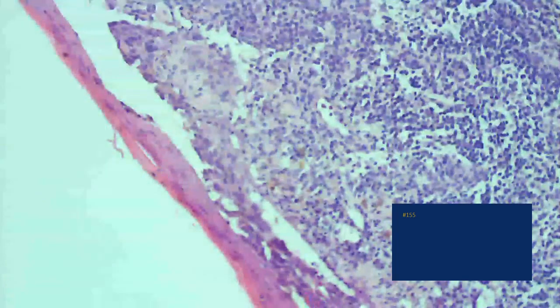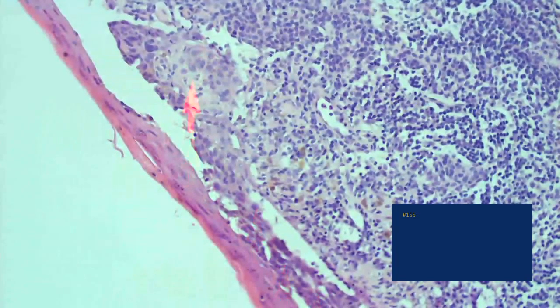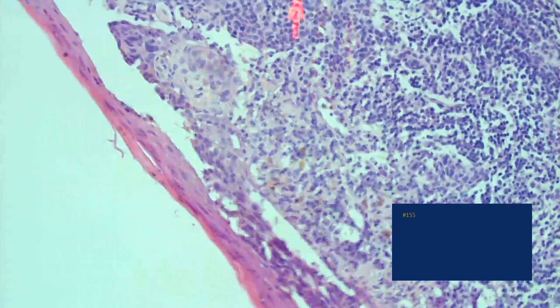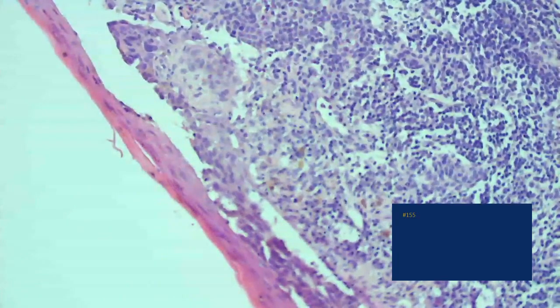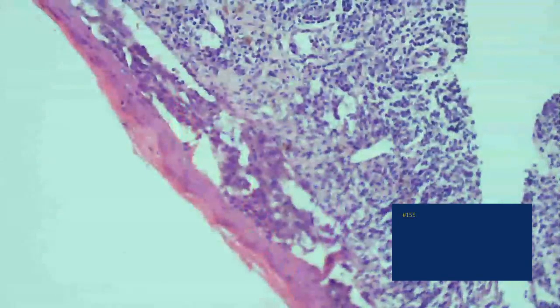And here we see at higher magnification that there is a neoplasm, and it's comprised of nests of cells, and they're at the dermal junction where they're a little bit epithelioid and spindle in shape, and then here they're more round, typical, and with the very dense inflammatory infiltrate, this looks like a nevus that's severely inflamed, and it's a little bit spitzoid right here. So, somewhat spitzoid.